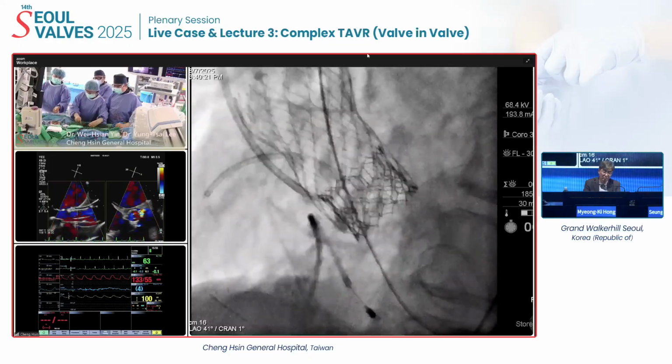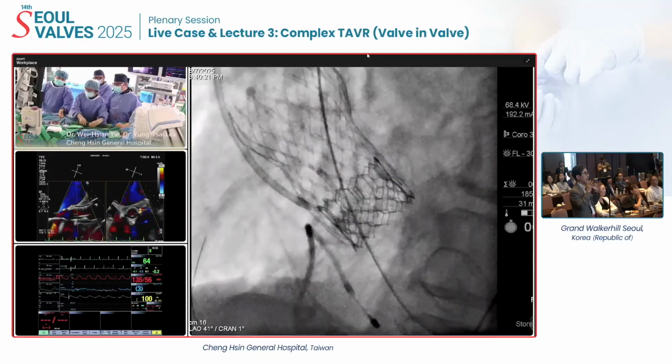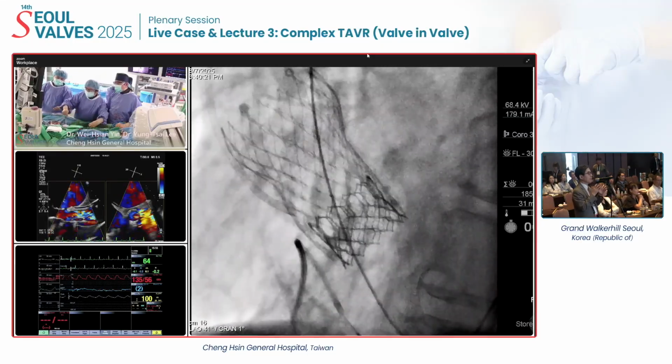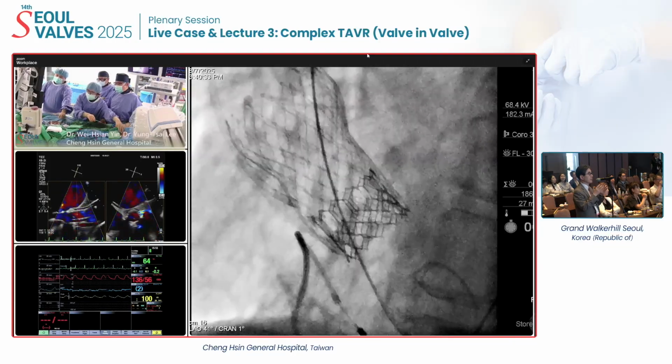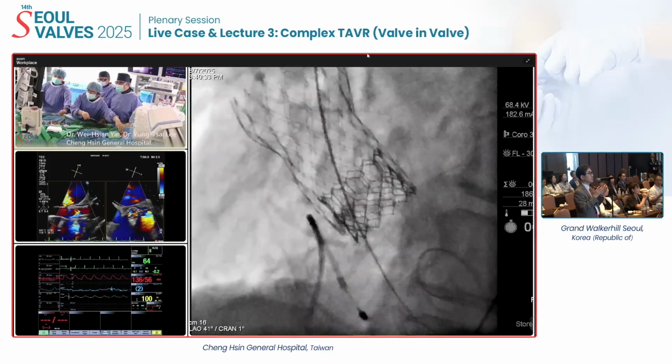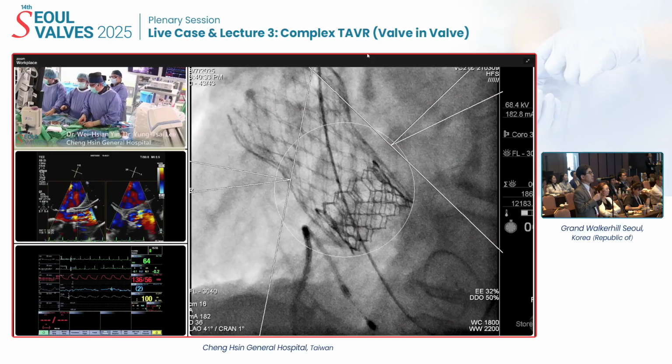Previously, I asked the question about hemodynamic instability immediately after balloon-guided tear of the leaflet. You also mentioned there is a severe regurgitation and hemodynamic compromise, thus you hurried up the implantation of the SAPIEN.